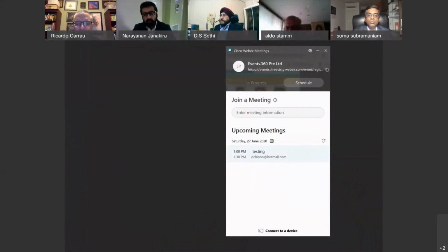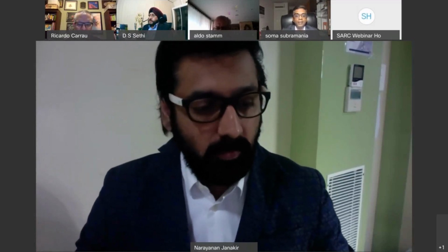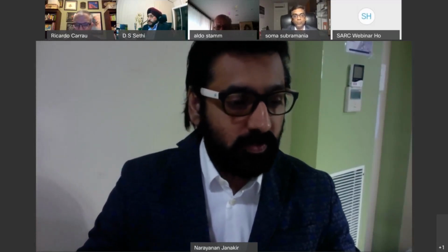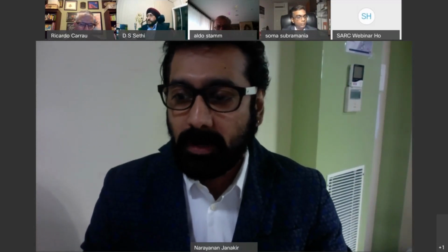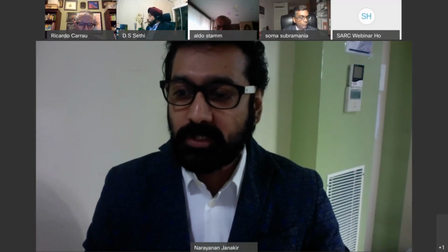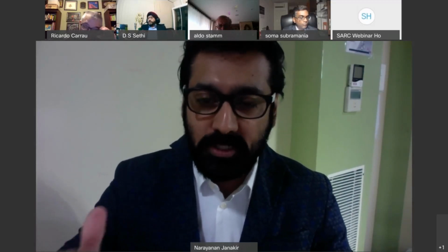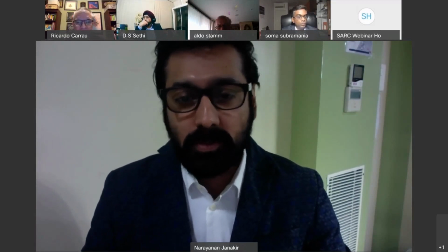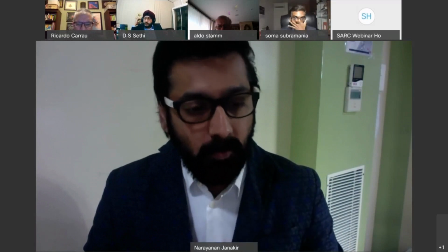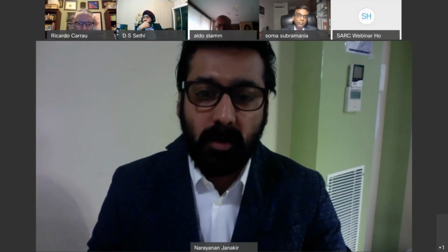That's my opinion. I have a question to both Professor Aldo and Professor Carrau, and of course, if Professor Sethi could answer, it would be great. Now, Professor Aldo was talking about the use of coarse diamond burr, which can produce some harm on the carotid. We have seen people using punches, the rongers, over the sellar floor and also on the planum. So, would any of you prefer using rongers to burrs? What is your take on that?